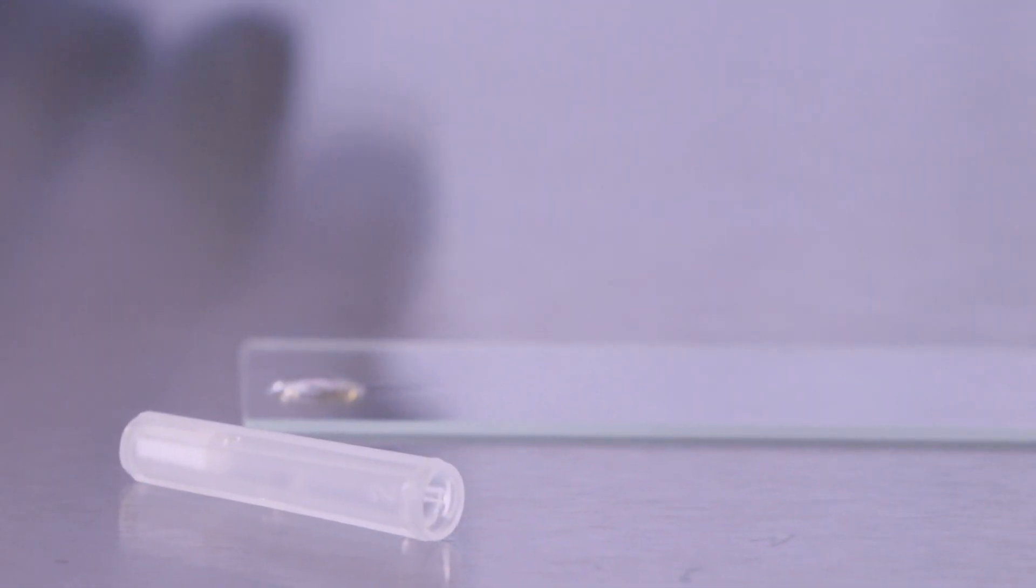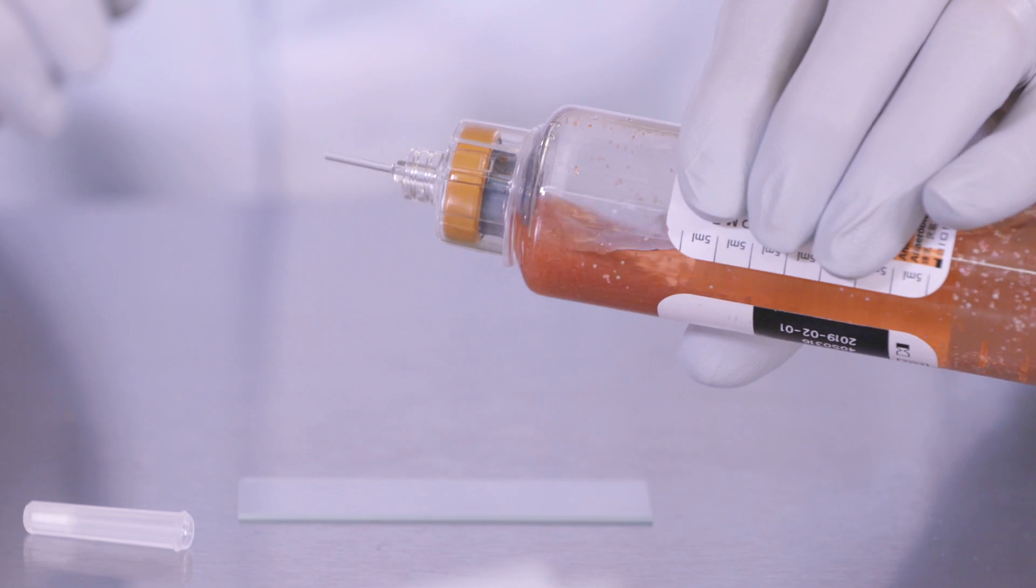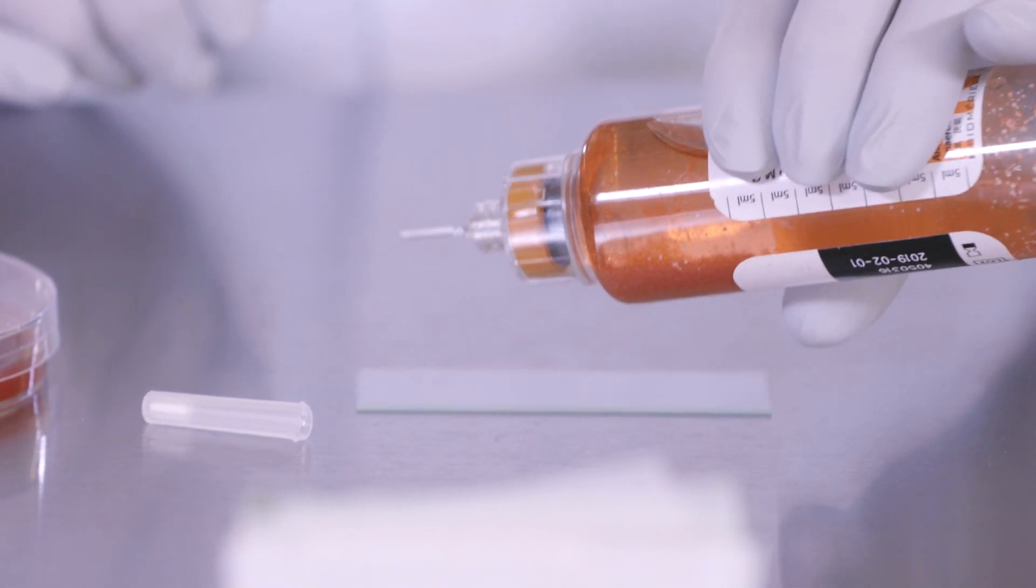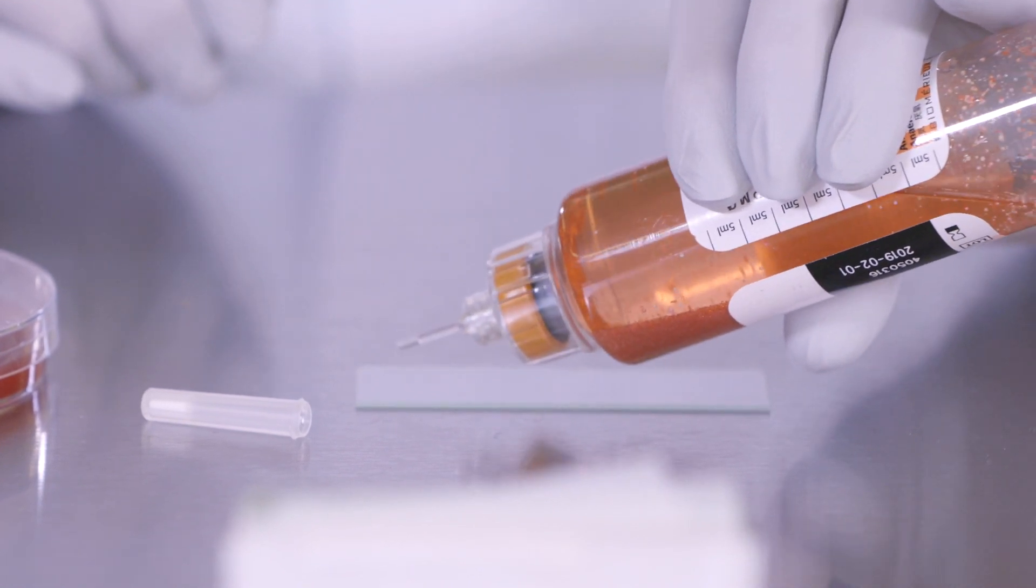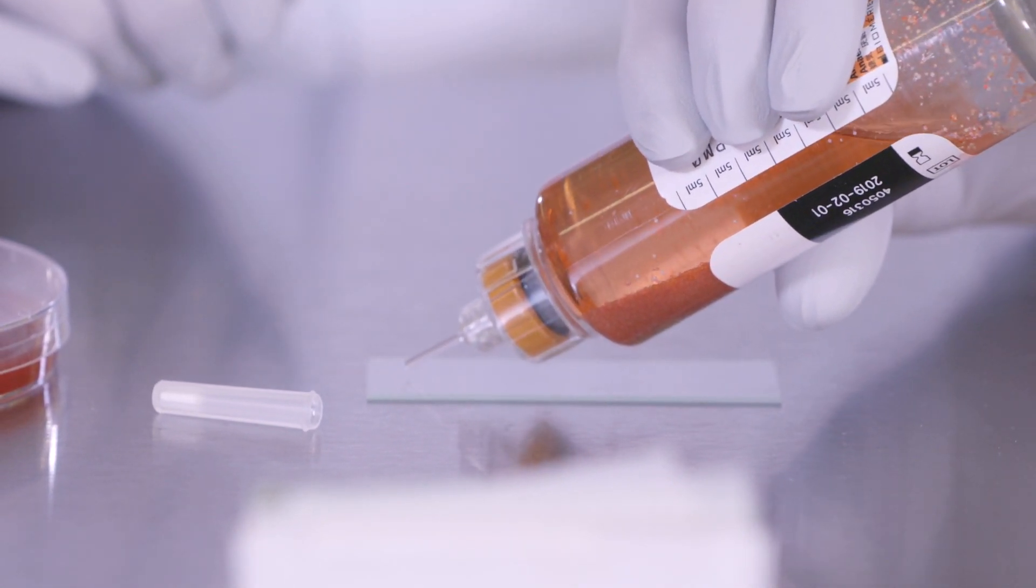If beads do obstruct the tip, this could interfere with dispensing drops. If resin beads obstruct the tip, tilt the bottle back and forth to move the resin beads away from the piercing tip. Allow resin beads to settle and resume dispensing sample drops.